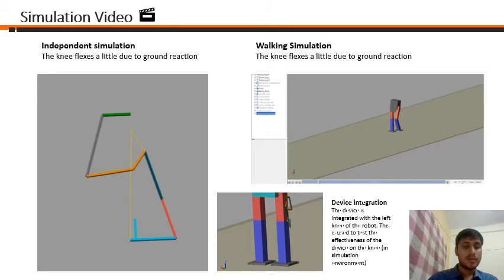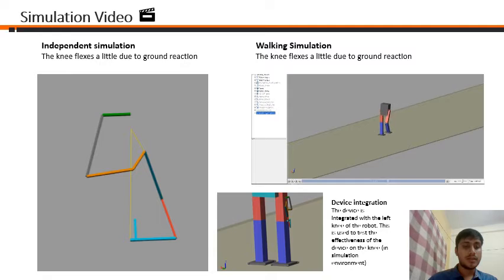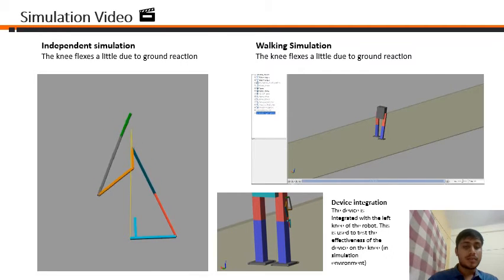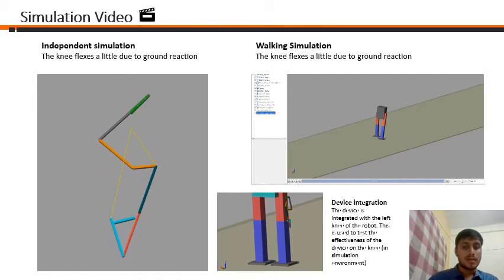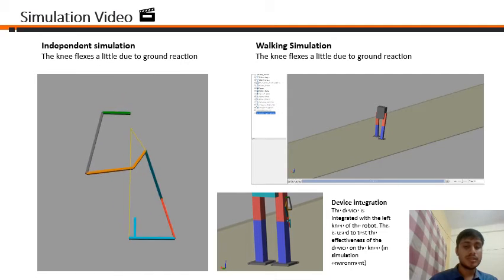Now we have the video of the mechanism independently and working with the walking robot. As you can see here in the video, the spring is stretched almost half the cycle and this provides extra stiffness to the knee at which the body is balancing. In the next phase, it pulls the string which is used to bend the knee.